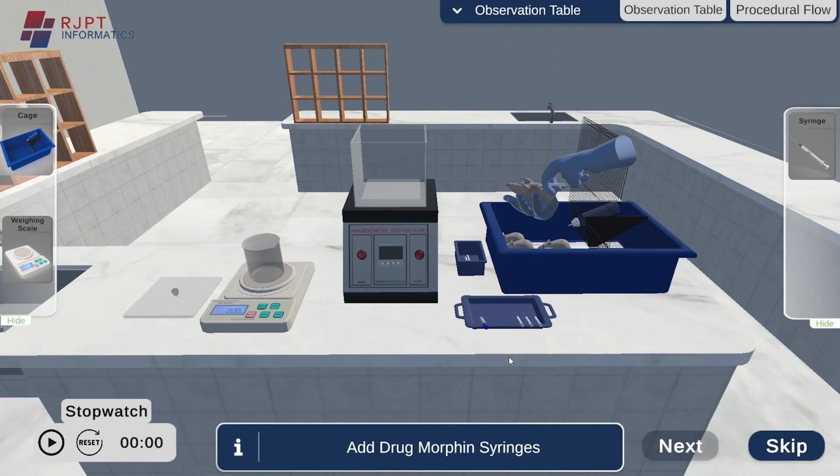We will try to make this experiment as least pain-inducing as possible, so that the animals do not feel any kind of over pain, and we do not make them suffer. The animal should not suffer any more than the procedure of the experiment requires.